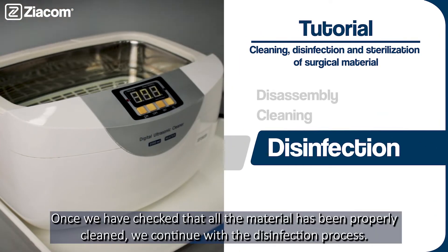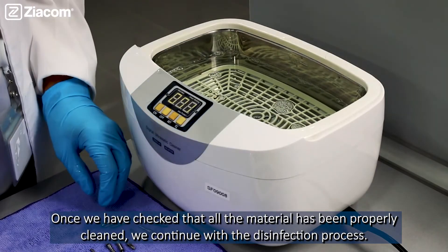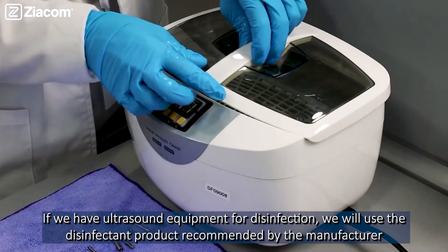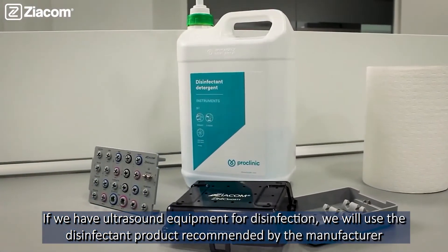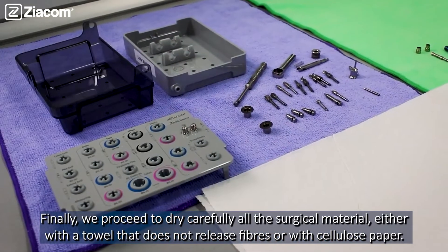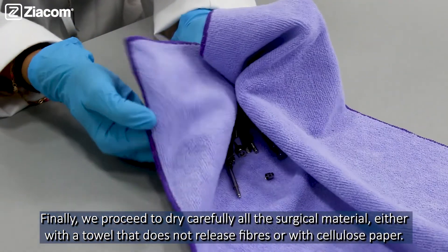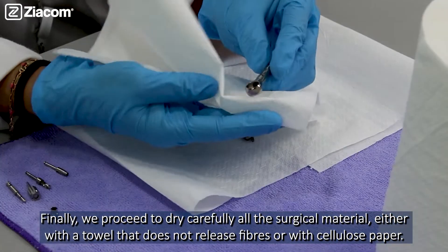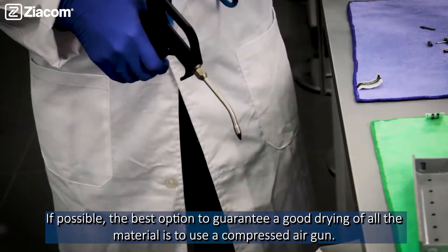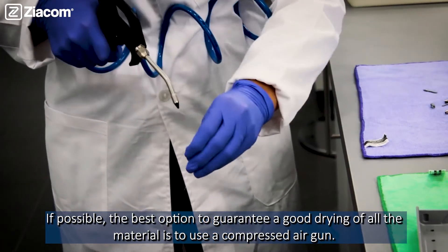Once we have checked that all the material has been properly cleaned, we continue with the disinfection process. If we have ultrasound equipment for disinfection, we will use the disinfectant product recommended by the manufacturer and always follow the instructions for use. Finally, we proceed to carefully dry all the surgical material, either with a lint-free cloth or cellulose paper. If possible, the best option to guarantee good drying is to use a compressed air gun.